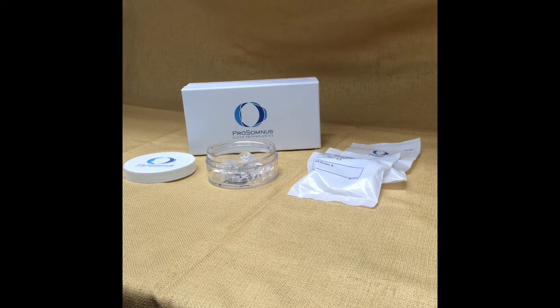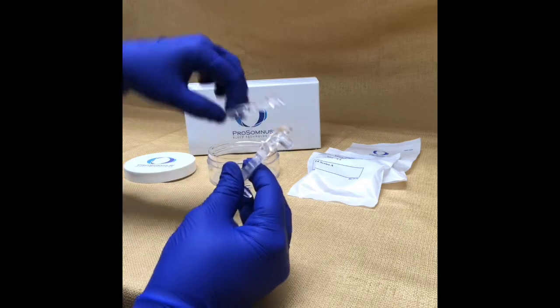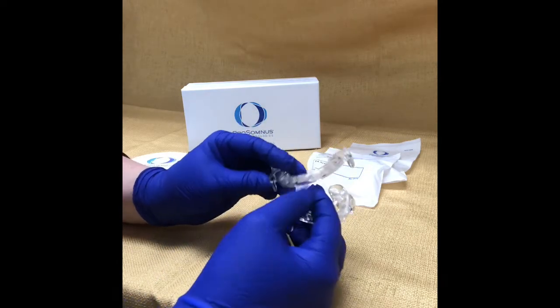Let's talk about how to calibrate or adjust your Prosomnus tray. The beauty of the Prosomnus tray is there's not a lot you have to do in terms of mechanical screws or anything like this, at least not the ones that we make in our office. All you have to do is, just like Invisalign, you change the trays out to a different combination.